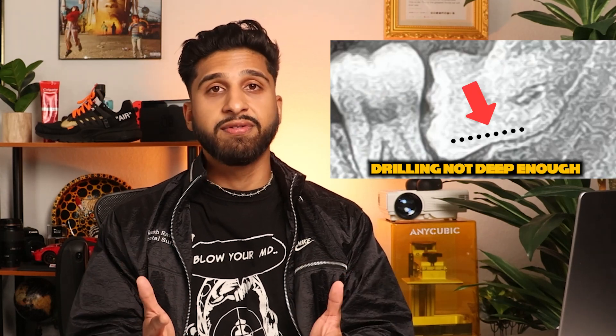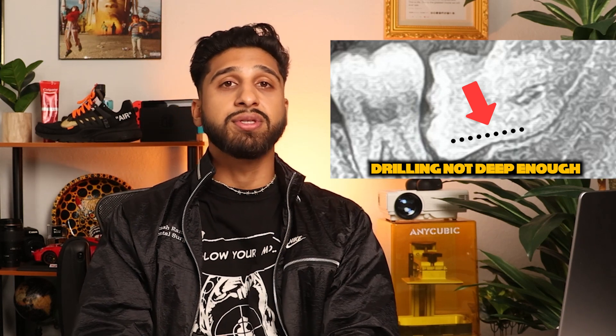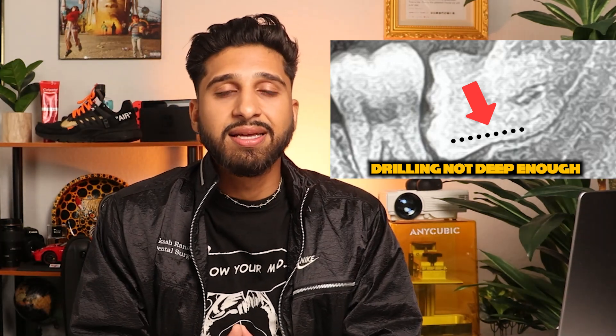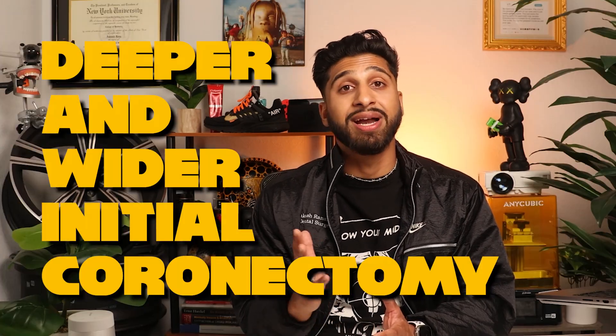Before we finish up, let's take a quick look at this x-ray and see how we can improve on the case. This was the moment during the procedure where I encountered some difficulty and felt unsure about the next steps. Upon analyzing the x-ray, I recognized that my drilling wasn't deep enough or wide enough as it should have been. Consequently, I wasn't achieving a good purchase on the tooth or obtaining the desired mobility. Another observation is the burr mark, which shows the angling of the handpiece — a common tendency is to inadvertently drill towards the back of the mouth instead of maintaining a more straight position. In hindsight, I wish I'd angled the handpiece more accurately to ensure a deeper and wider initial coronectomy.